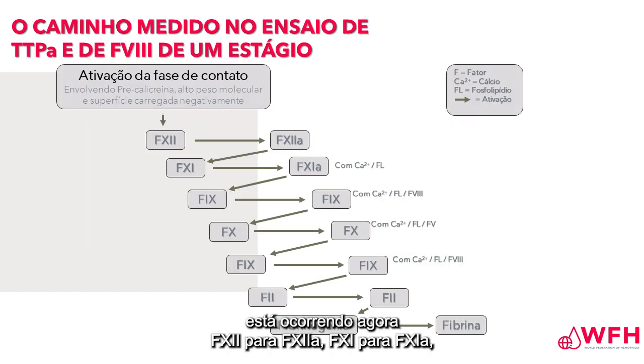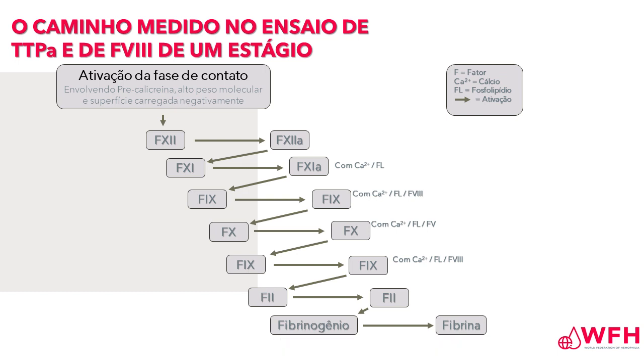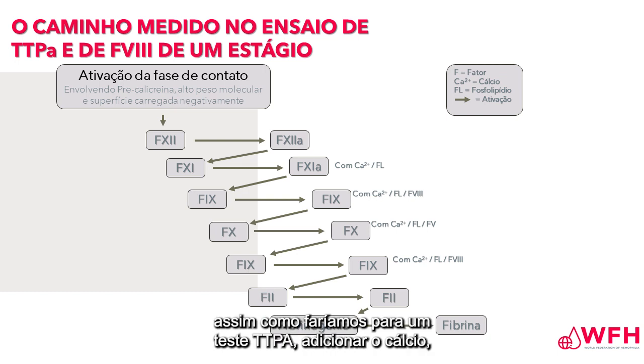Contact activation is now occurring, 12 to 12A, 11 to 11A. We don't have essentially any calcium present, so at this moment we're simply activating. In 3 minutes, just as we did for the one-stage factor VIII assay, just as we would do for an APTT, add the calcium, record the endpoint.